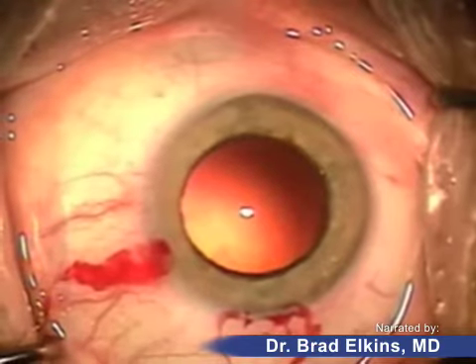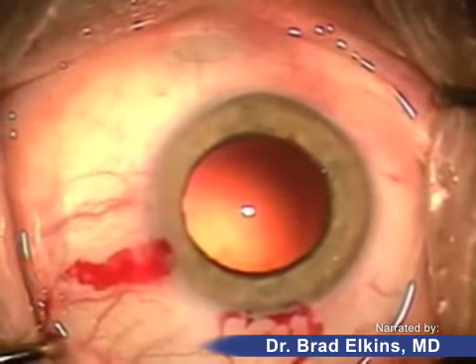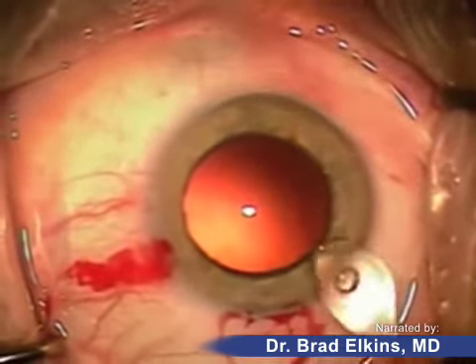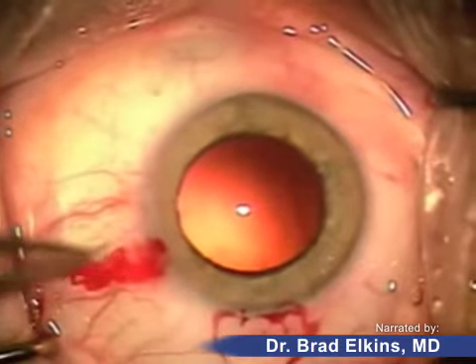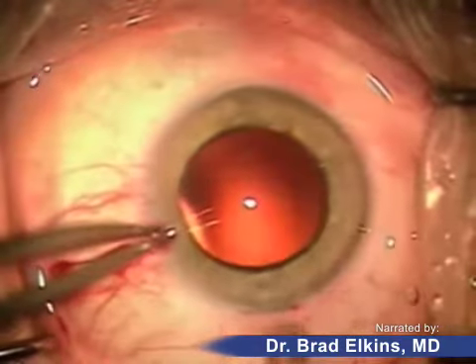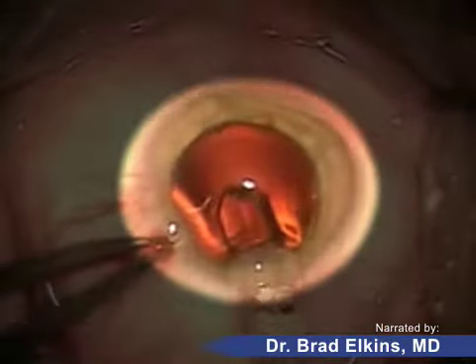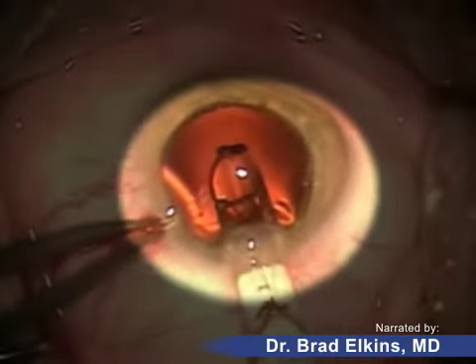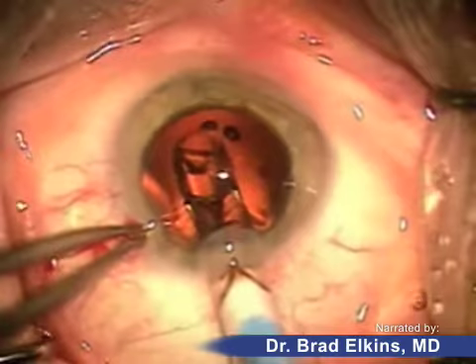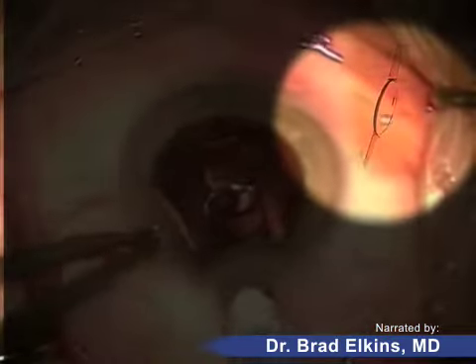The lens is being folded and prepared. Now the cartridge is being inserted and you'll see the lens being pushed forward. The little hooks called haptics will be the first thing to come out — these hooks keep the lens in place within the capsule or bag.